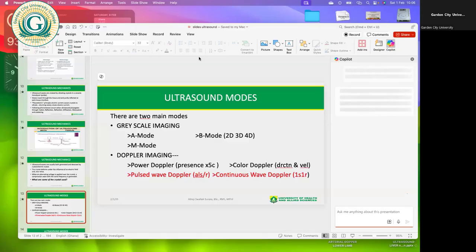So the images that we usually see on our screen in ultrasound are 2D, they are superimposed. But we also have 3D ultrasound, which allows you to put form to that 2D image that you've seen. I hope I'm making sense. So 3D is what people usually visualize and say, oh, wait, there's the baby.